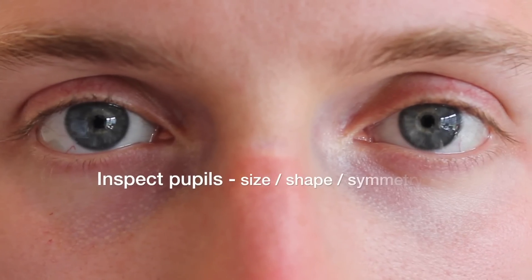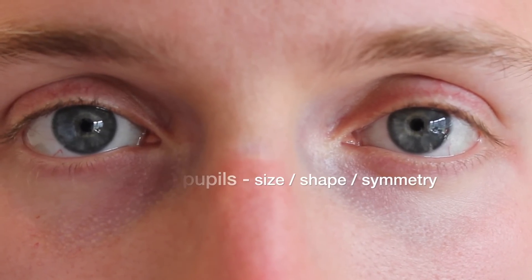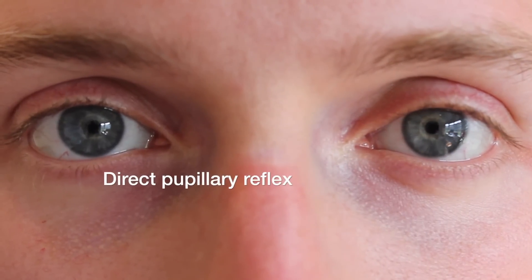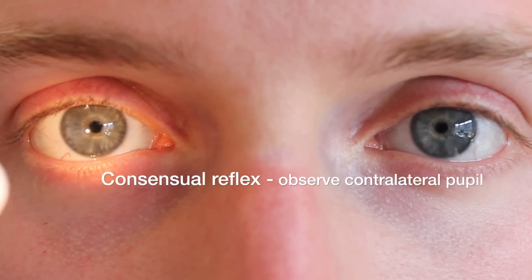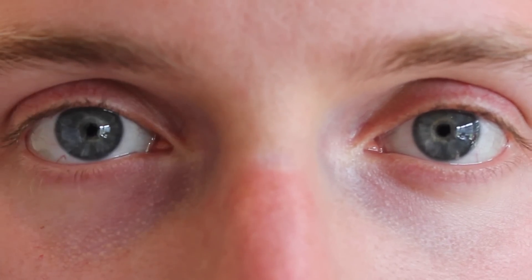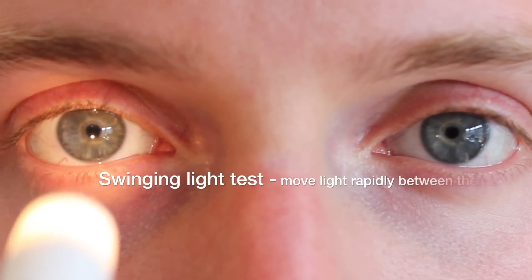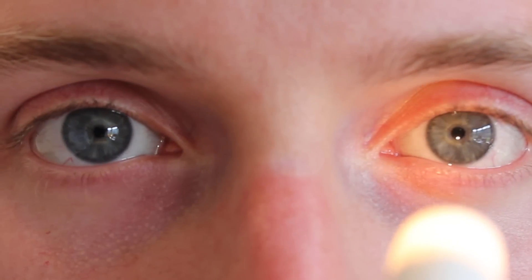Now I'm going to have a closer look at your eyes. It's going to involve me shining bright light into your eyes which might be a little bit uncomfortable, but it should be reasonably brief. So if you can look straight ahead for me.